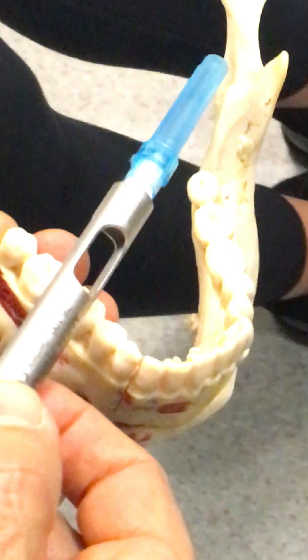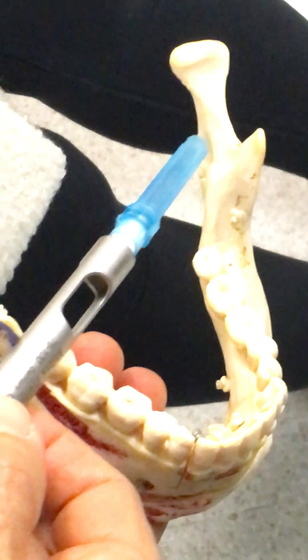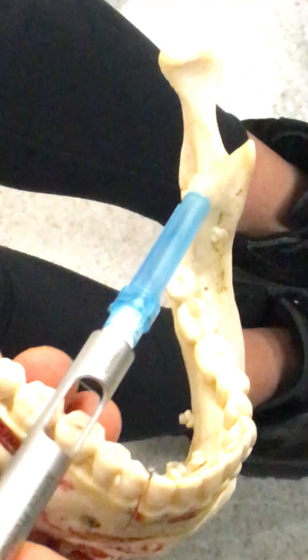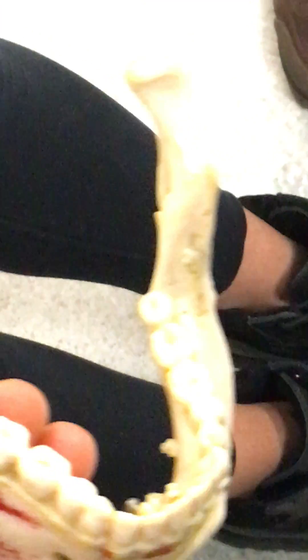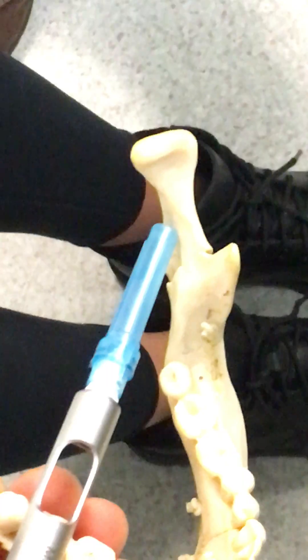Coming straight across, just like that, and you're just contacting the bone, usually posterior and superior to the lingula. If you are below the lingula, you will get nothing — because what attaches to the lingula in this area is a ligament, and you'll never be able to infiltrate through that ligament. It's impossible. So that's one of the reasons why the block won't work — you're too low. The joke always is: aim high. Make sure that you're above.